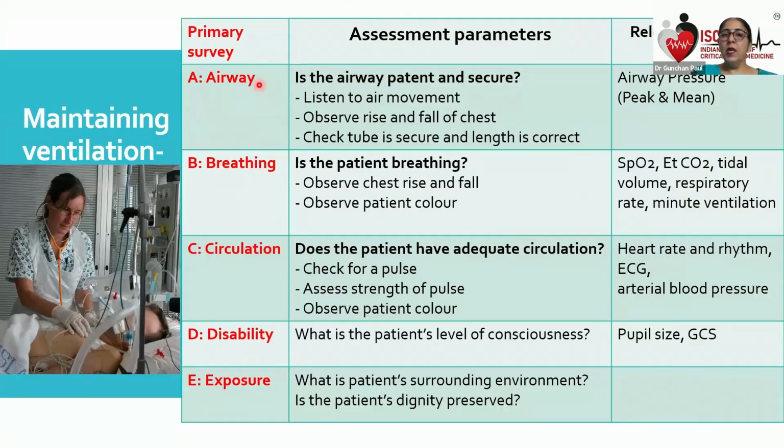We will go ABCD. Assess the airway. Is the airway patent? Is the tube blocked? You listen. The tube has not come out. There are no abnormal sounds. The chest is rising and falling. The tube is secure at its proper point. The patient is breathing. What is his saturation? What is his end tidal value? What is the monitor showing for the tidal volume? Is the tidal volume being delivered or not?